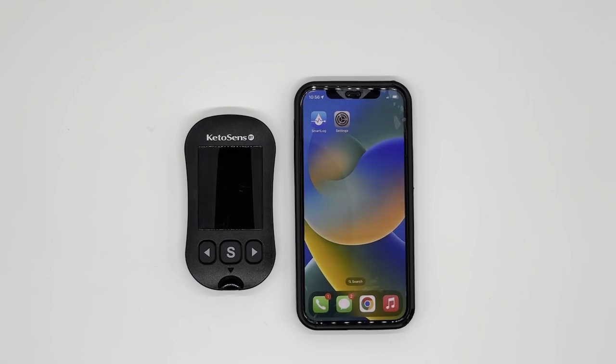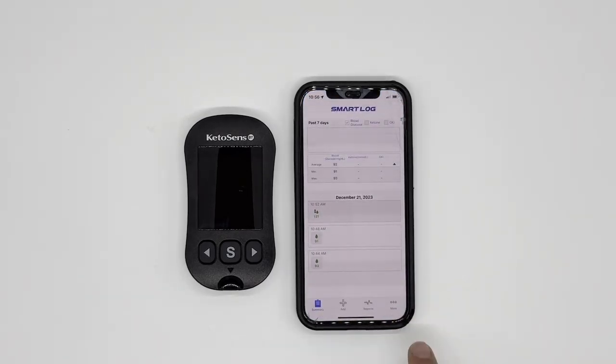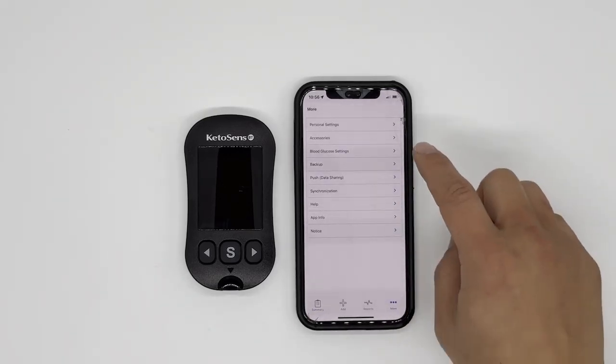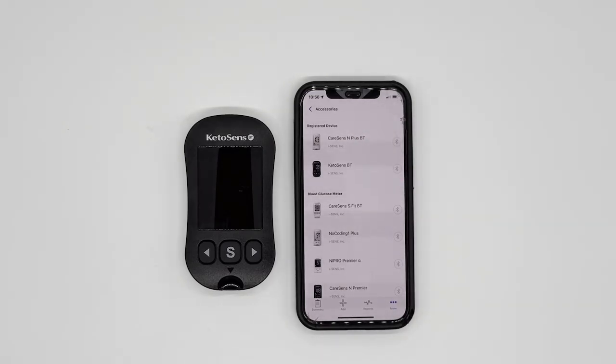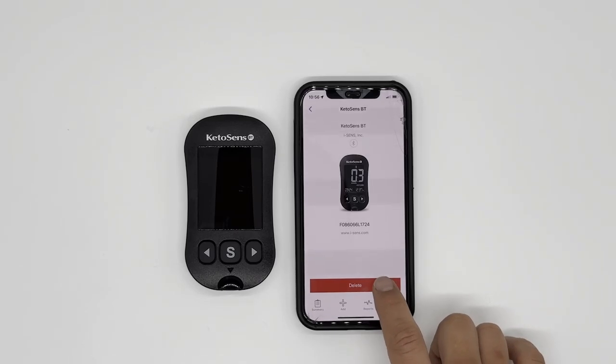This first step is really for people who have tried multiple times and keep on failing — this will help you resolve that. So first, let's go to SmartLog. Bottom right, there's 'More.' Second from the top, there's 'Accessories.' You may or may not see KetoSense BT on the list under registered devices. If you do, and you have failed connecting, please delete KetoSense BT.